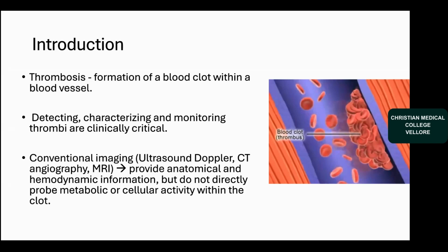If we look at conventional imaging like ultrasound, Doppler, CT angiography, and MRI, they provide anatomical and hemodynamic information, but they do not directly probe the metabolic or cellular activity within the clot. So there comes the role of PET-CT.